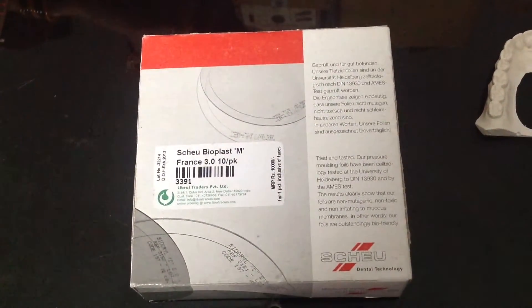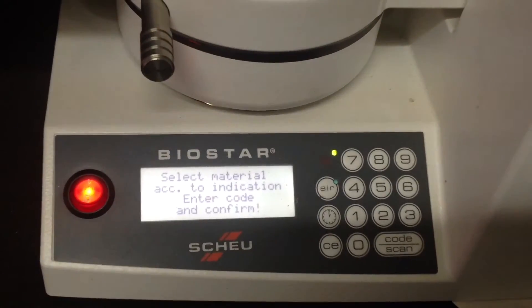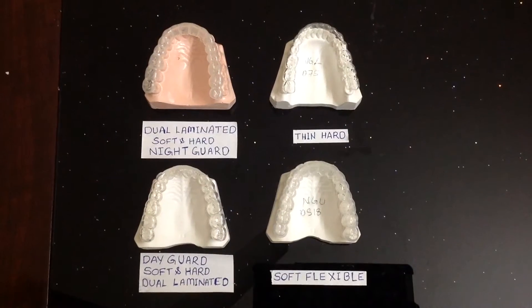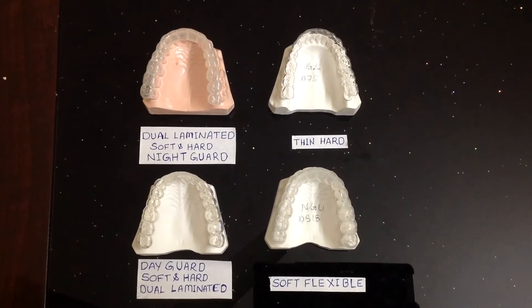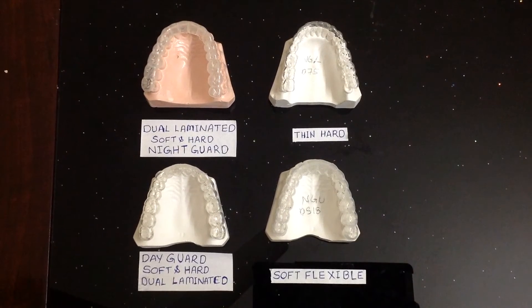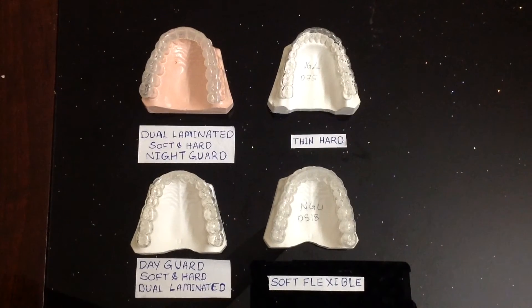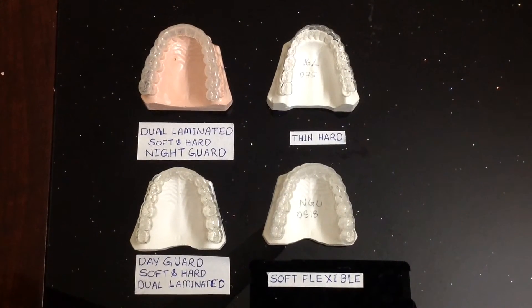We use the products of Scheu and Erkodent of Germany. We use the Scheu Ministar for the fabrication of the mouthguards. While selecting the mouthguard, one has to determine which is the best suitable splint for your patient. Some are better for clenching, few are better for grinding. Some are nightguards and few are dayguards.